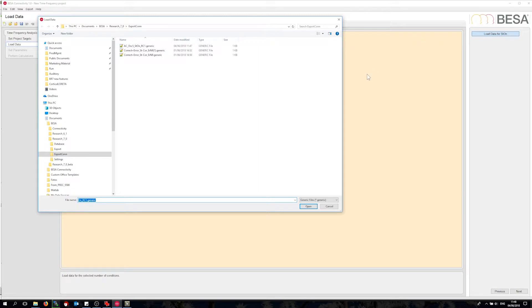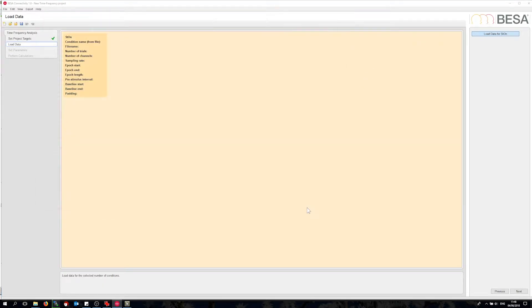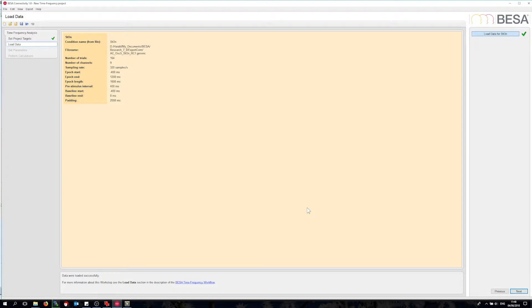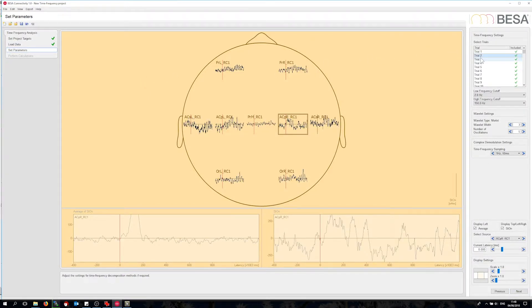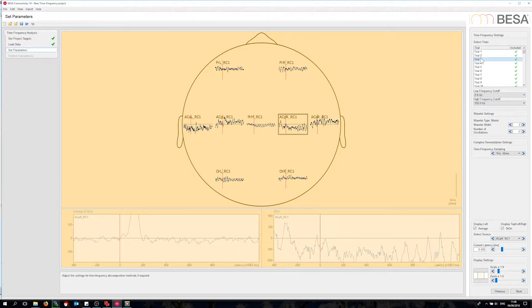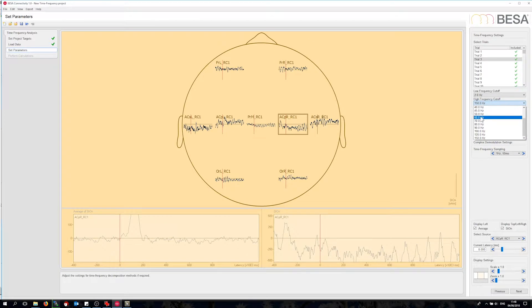The data are already pre-selected as the ones I just exported from BISA research. I can see a summary of the data here. The next step gives me a trial-by-trial overview in the top viewer. I could now discard trials, but I am not going to since I already discarded the artifact trials in BISA research. I can also adjust the parameters of the time frequency methods, but I will stick with the default parameters. I will just change the maximum frequency to 50 Hz since we are not interested in high frequency activity in this experiment.